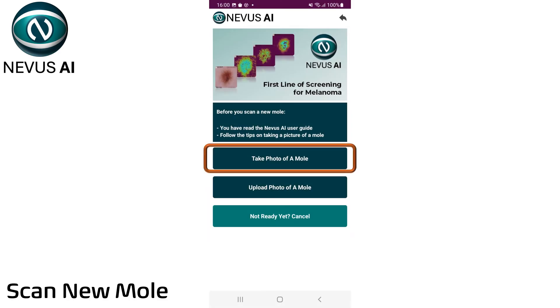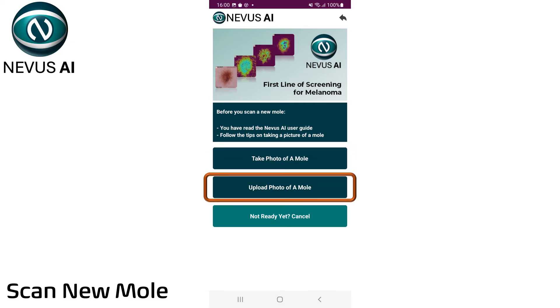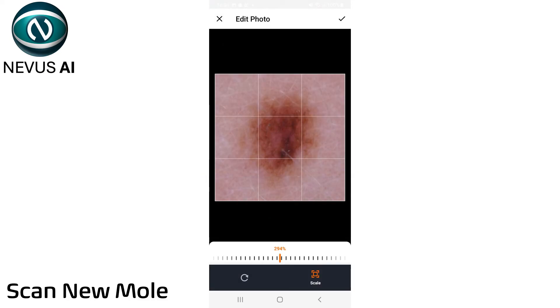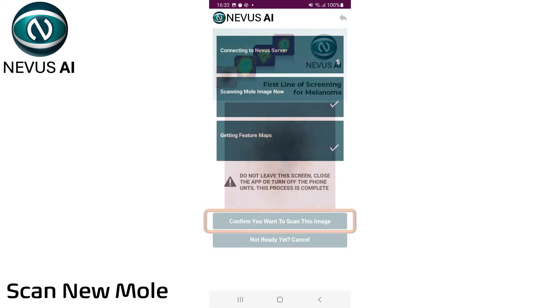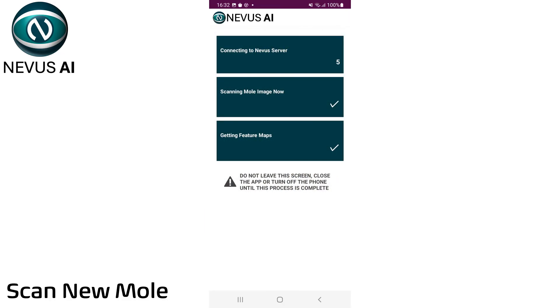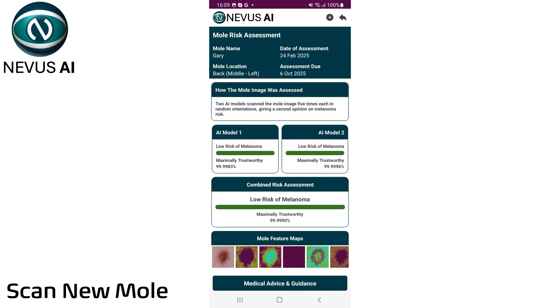Take a photo of the mole from your device camera, or select an image of your mole from your photo album. Position the mole within the photo if required, and then select the image. Confirm one last time that you are happy to scan this image of your mole. You will now be connected to the Nevis server. Ensure you have an internet connection, and that you do not close this screen or the application. In a few moments, you will be presented with your mole risk assessment.